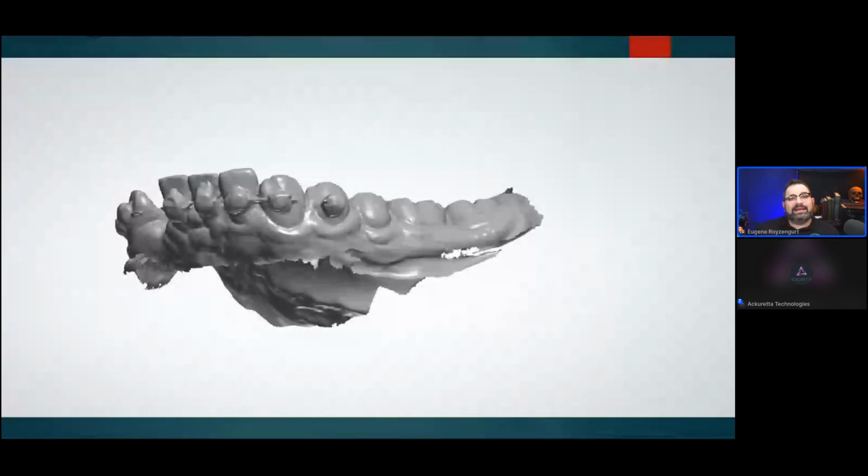But I do also recommend getting the bleach shades rather than A1 or A2, because I like to usually stain up, because these are still going to be quite opacious because it's a print, right? And to build the translucency and things like this, you can really achieve it a lot better by adding either OptiGlaze or accent stains to it. But if I'm just doing a temp, I don't usually do just the teeth. I do the whole thing in white, and I really like using the GC temp resin for that.